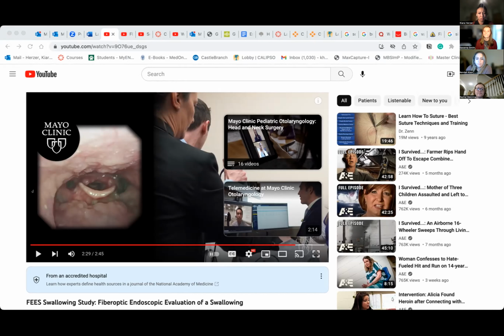Any other questions? Yeah, hi, I'm Kendall. I am Savannah's mom. I was just wondering, is there another way that you can assess possible swallowing issues in patients, or is this the only way? No, there is another way. It's actually called a modified barium study, or MBS. And so what exactly is an MBS? Of course, so the modified barium study uses X-rays to view a swallow and the structures and muscles used for swallowing.